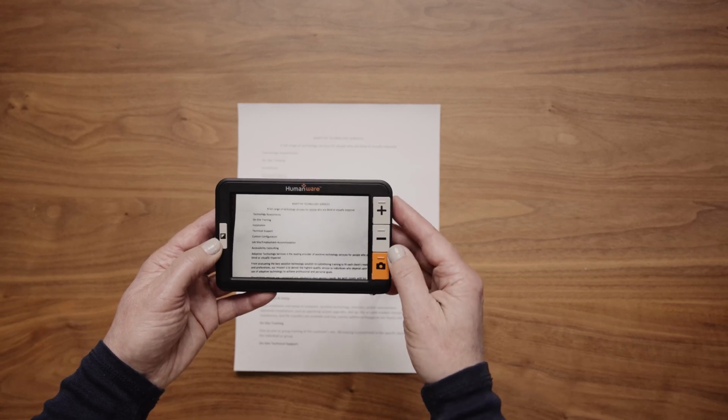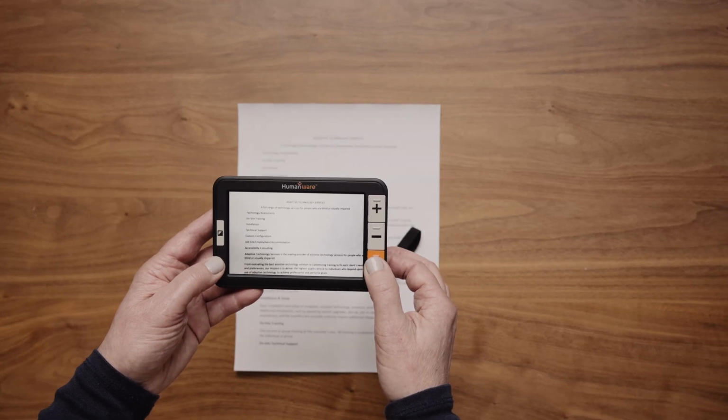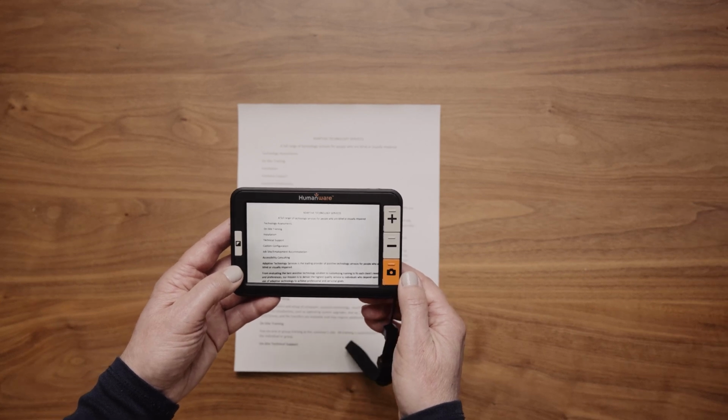Save an image. 1. Press and hold the freeze button on an image. Note, images can be saved in either the magnifying or freeze mode.